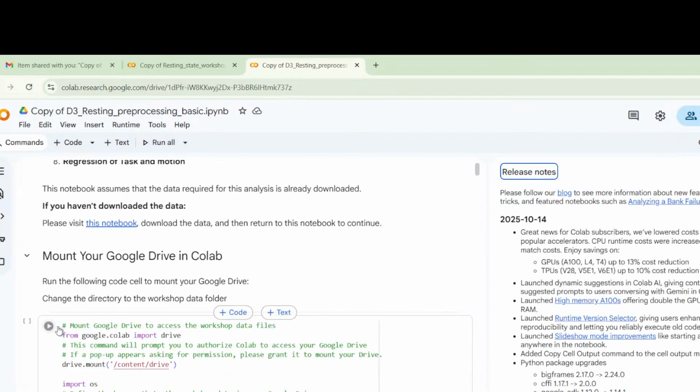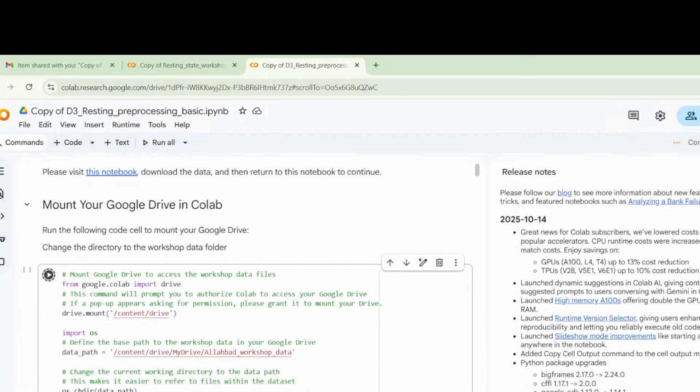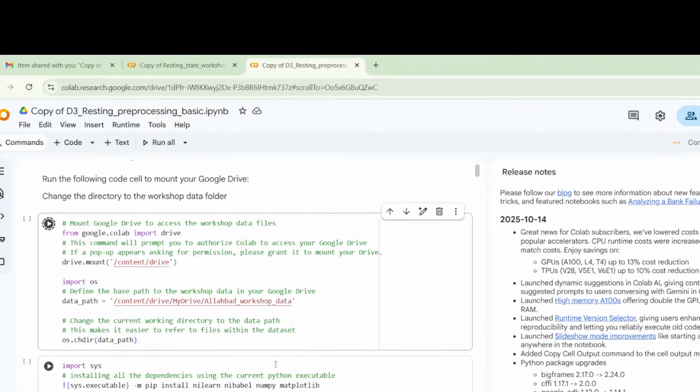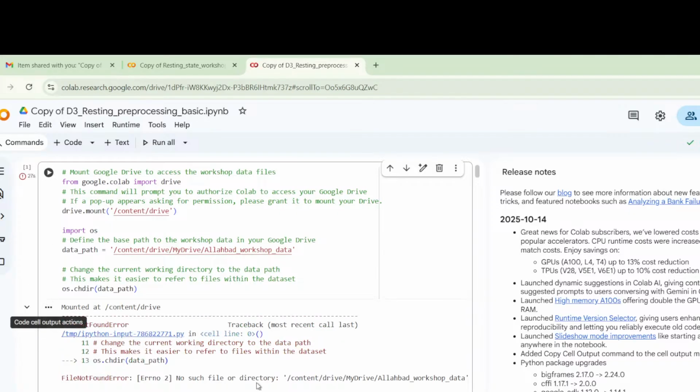Huh? Oh, which one is the best one? Okay, the best one depends on the question you are asking. A lot of times, typically, least square is good and it's fast. But sometimes if you are trying to, let's say, give anesthesia, right? With anesthesia, there is a change in intensity. So in that case, least square won't work well. So in that case, you should use mutual information, okay, or other criteria, but generally mutual information is good, okay, right?